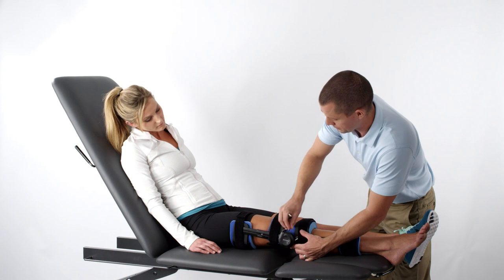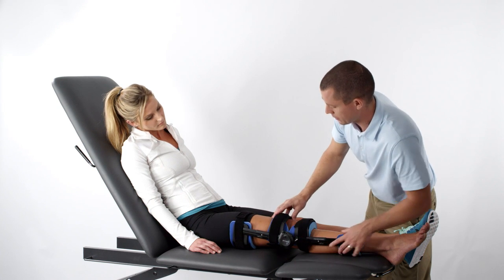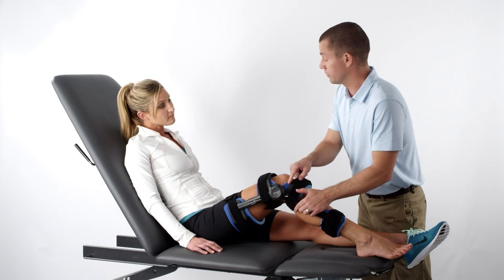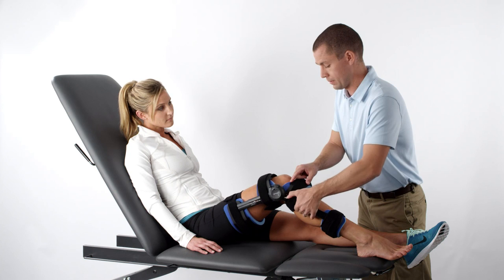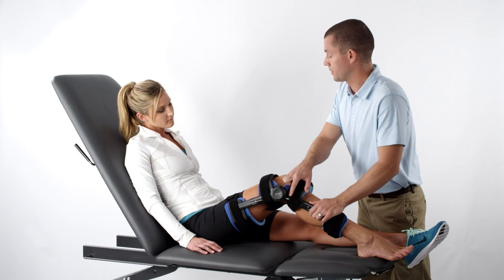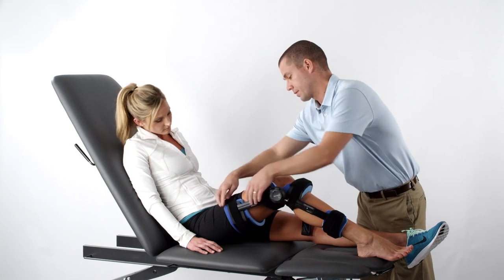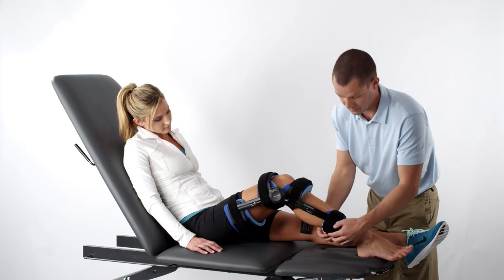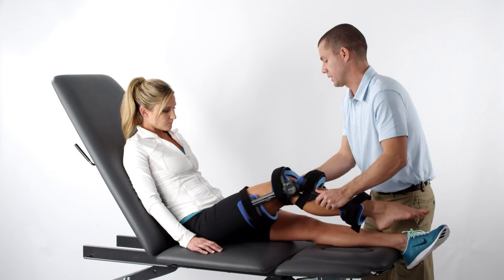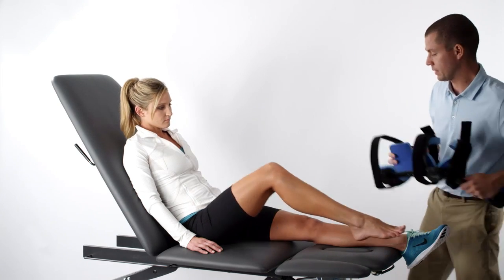Also make sure the patient is maintaining the required wear time per day and adhering to the post-wear criteria for soreness. Once the patient has reached their wear time limit, remove the advanced knee orthosis. Lock the device into position at the patient's current end range. Secure the safety. Unfasten the adjustment straps. Then remove the leg from the device.